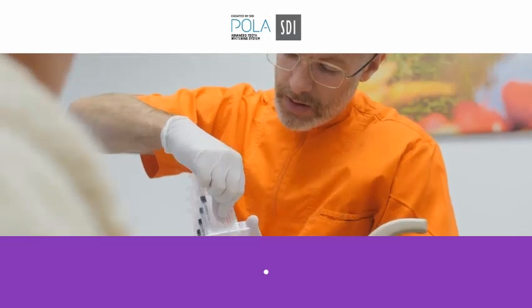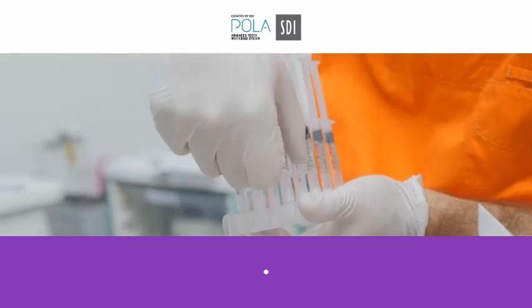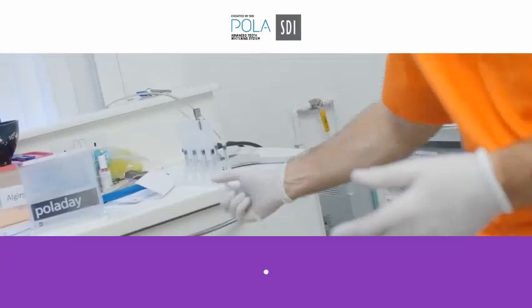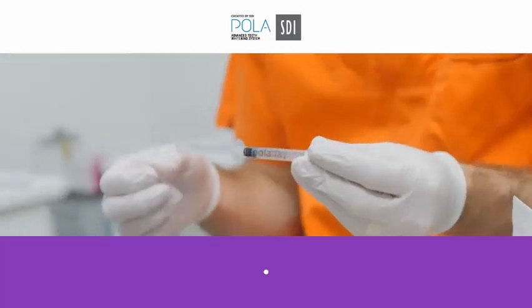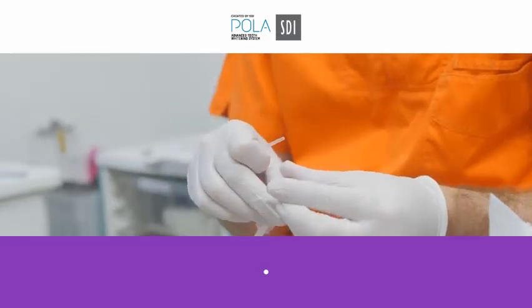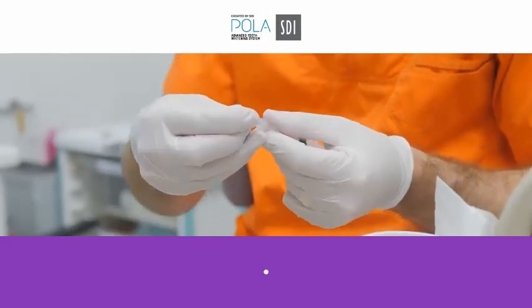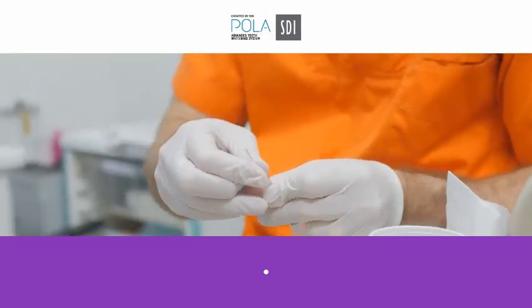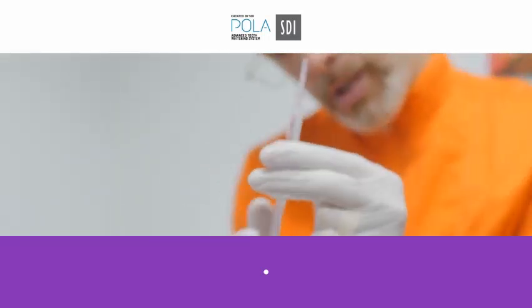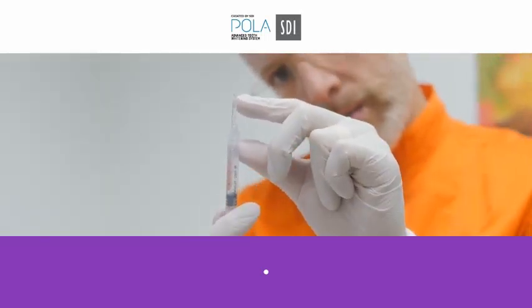These little tips come off and they turn. You take one syringe up. I often say to patients, these syringes should last you 3 or 4 days easily. The amount of gel you actually need to whiten teeth is hardly any, at the slow pace that we do them. So this goes on there, turns, nice and tight. And what you can see at the end there is you push the little plunger slowly up, and you'll see the gel start to come out.